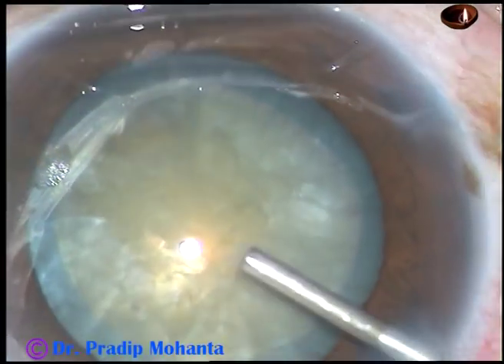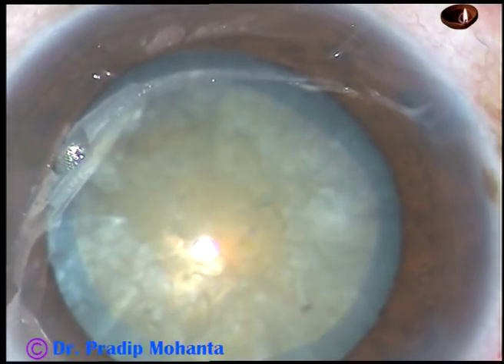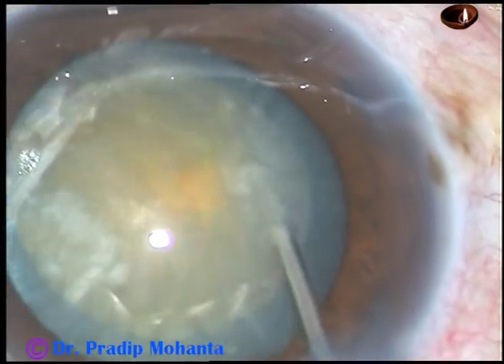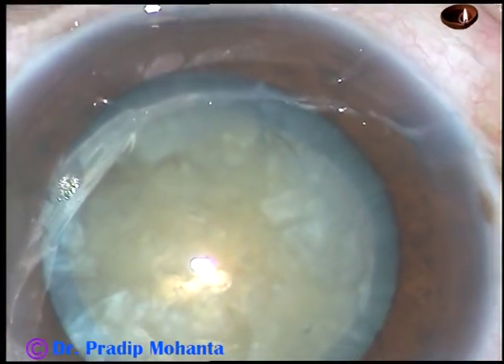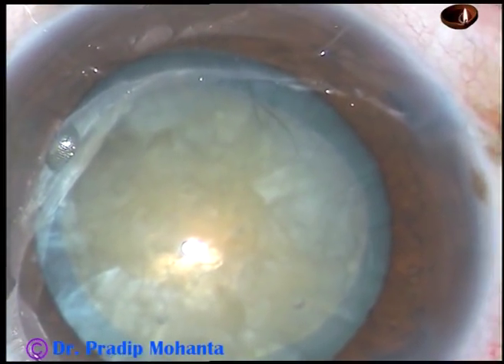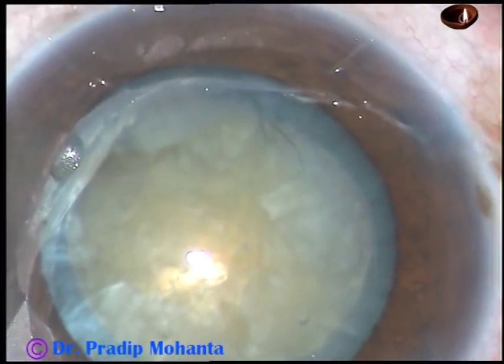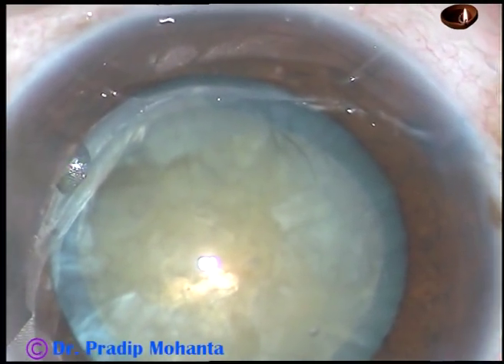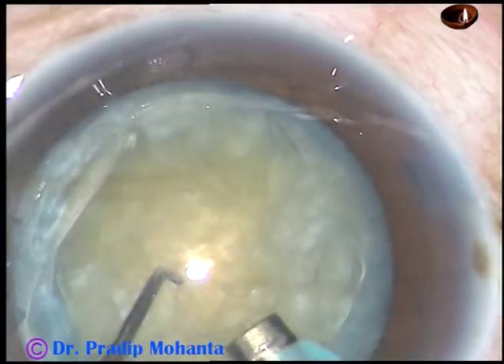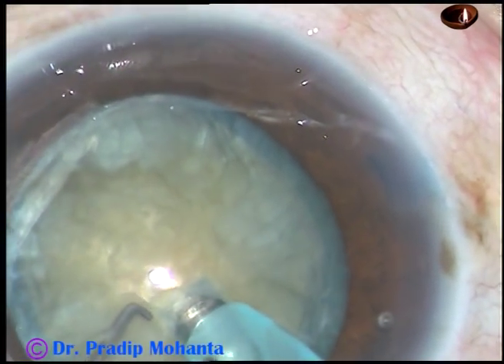Do I need any hydrodissection? Let us see if I can rotate the nucleus. Yes, I can rotate the nucleus, so hydrodissection is not required. This is another feature of pre-intumescent cataract — if we can rotate the nucleus without hydrodissection, we can call it pre-intumescent.